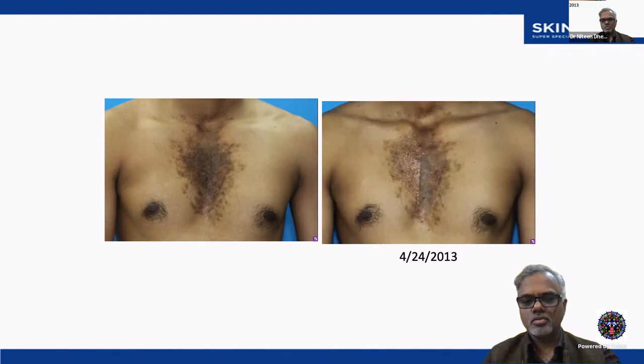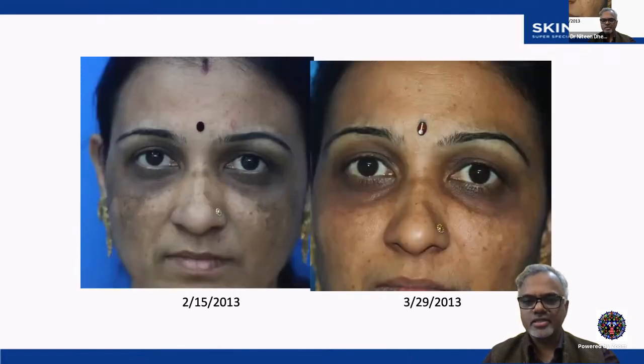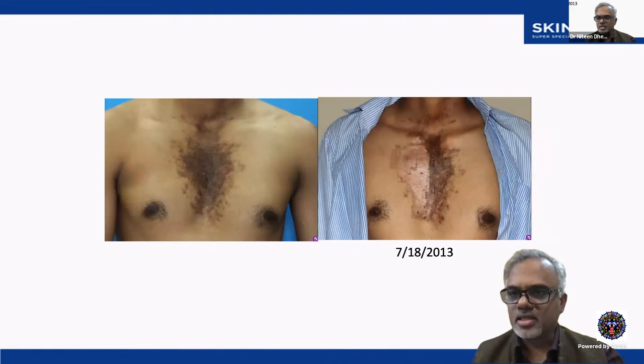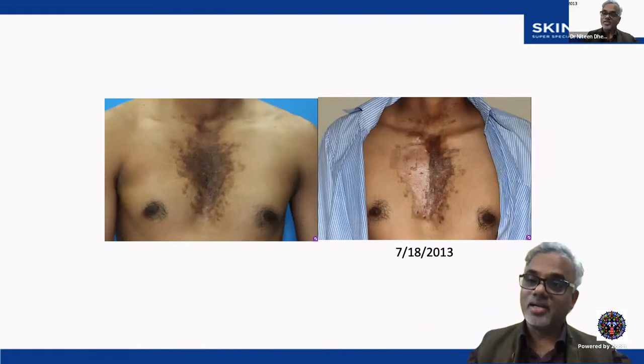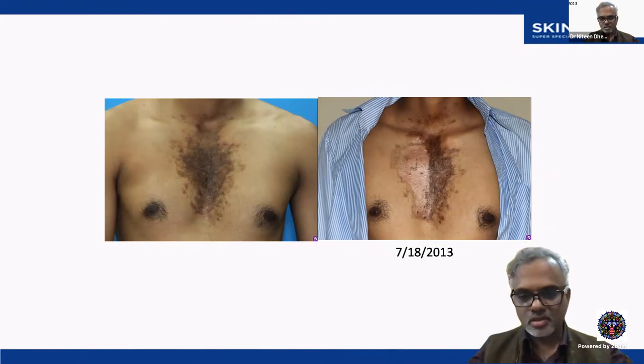And to our surprise, the side treated with this vascular laser has no scars and better clearance of pigment than the side treated with the Q-switched Nd:YAG laser. So this vascular laser is a better pigmentary laser in black birthmarks or black spots. That was a very different finding from what other people used to believe. So this is an innovative use of lasers.